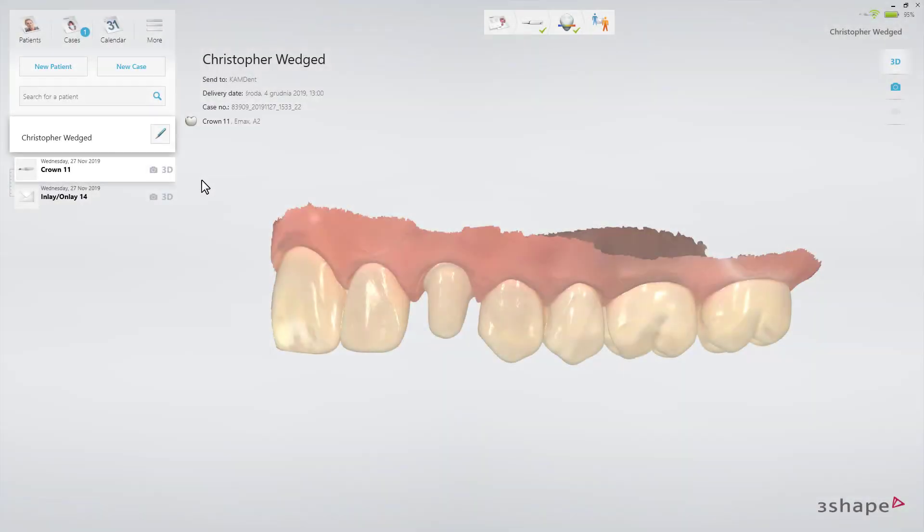This video will demonstrate the workflow for single implants. Starting on the patient's page, click on New Case.